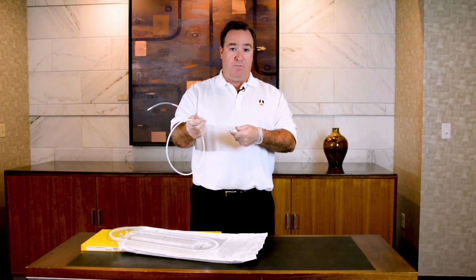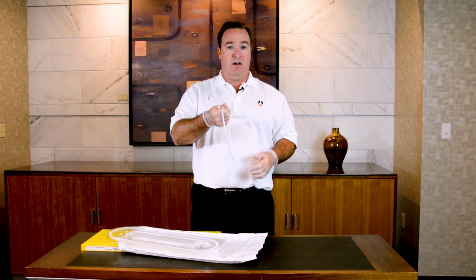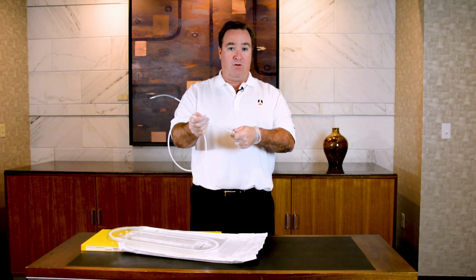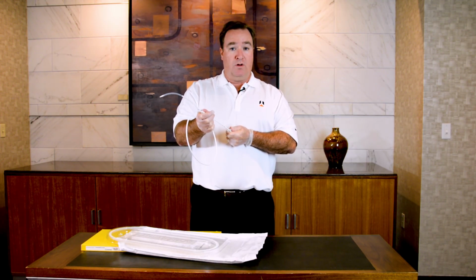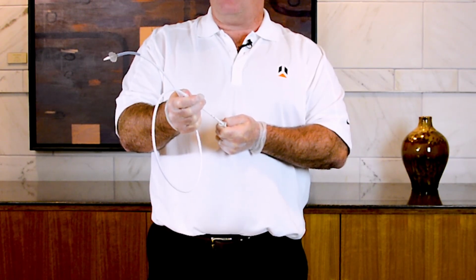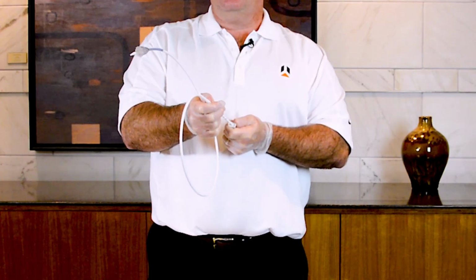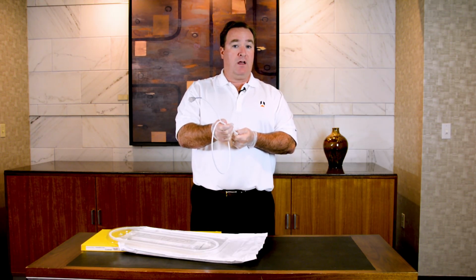So once you have the stent properly positioned, you're then ready to deploy the stent. The key is to pin the back of the stent catheter. Some people will actually pin it onto their chest so that it doesn't move, or you can pin it with your back hand. Once you've done that, then slowly start to pull the forward part of the catheter backwards, and you'll start to unsheath the Bonastent. We suggest going extremely slow while you're deploying so that the stent doesn't move forward or a misplacement occurs.